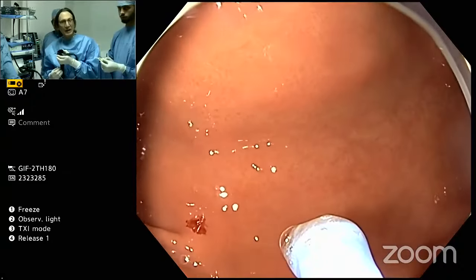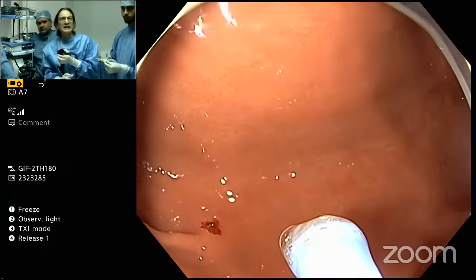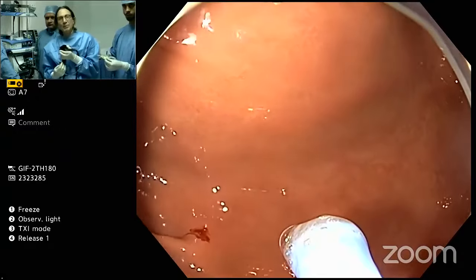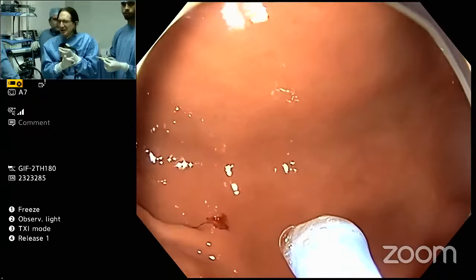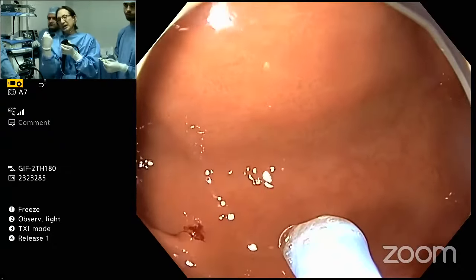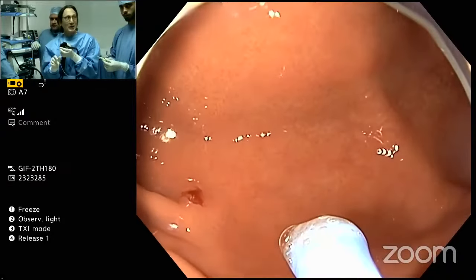Now, you saw yesterday the three-pronged anchor from Ovesco. It was not designed as an anchor, but really designed to enable closure of defects where you could go in and catch the tissue deeply and pull it in. But the problem with that three-pronged anchor, it looks a little medieval, a bit barbaric. You're a little scared because those spikes turn upwards. And you saw yesterday how some of those spikes had already gone through the lesion on the mucosal side of that leiomyoma. So I don't think that three-pronged anchor, in its current form, is the ideal way of doing it.